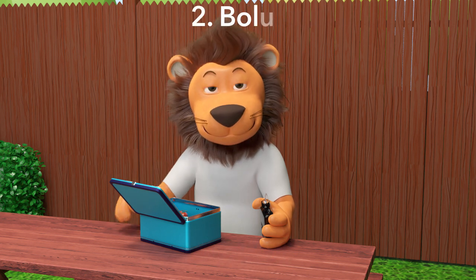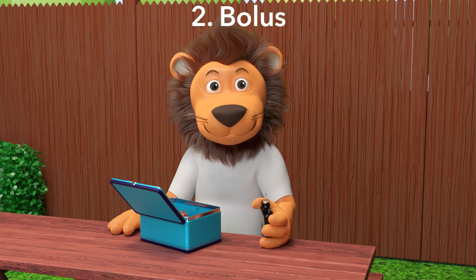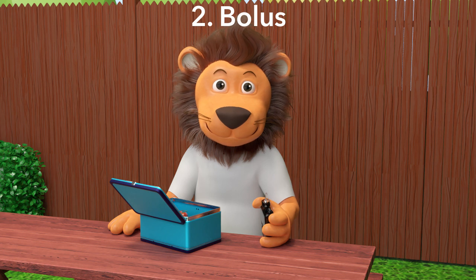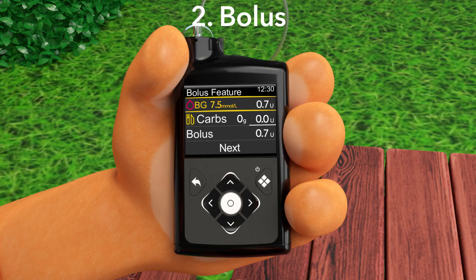Now that we have counted the carbs, the second step we need to take is to tell the pump that it needs to give you a bolus for your lunch. But how do we do this? It's easy! Take your pump and go to the bolus feature. Your parent can help you with this if you're not sure how to do this. The bolus feature of your pump may look slightly different, but it will work in a similar way. First, the bolus feature will look at the glucose level in your body, whether you have put in a blood glucose reading using your glucose meter, or the pump takes your glucose reading from your sensor, and then it decides how much insulin to give you for your glucose level.